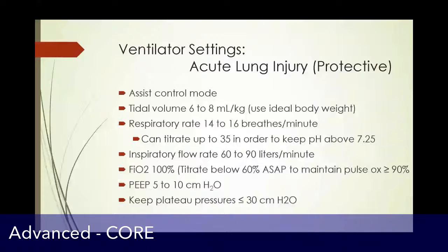And this is the most important, the protective part of this whole method, is keeping the plateau pressures below 30 centimeters of water. You don't want any more pressure inside the lungs, or you can cause barotrauma, can cause a pneumothorax, cause worsening of the lung disease.